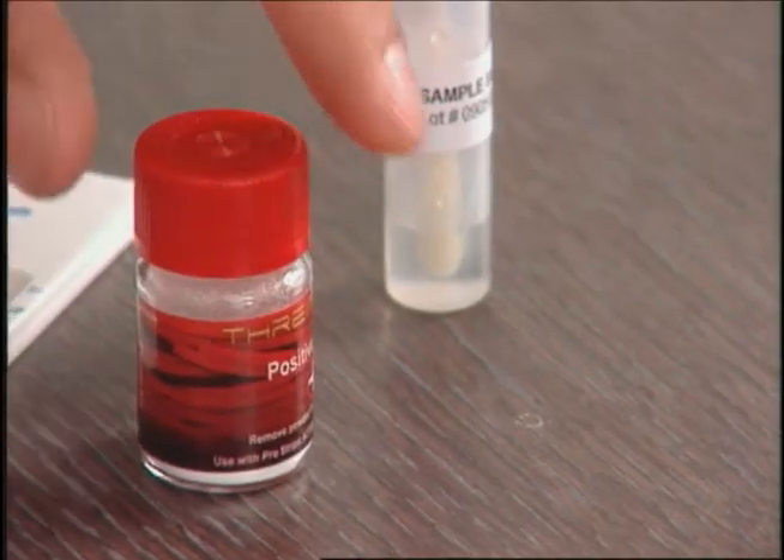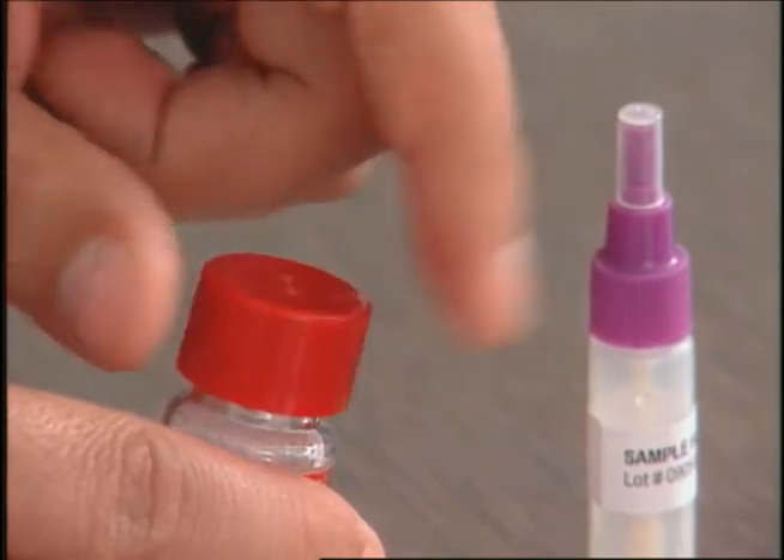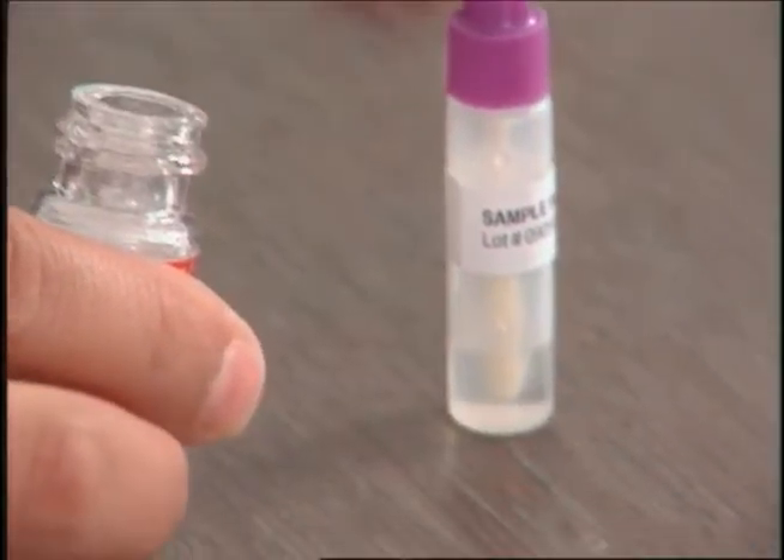In this demonstration, a positive simulation powder for anthrax is used as a suspicious substance.